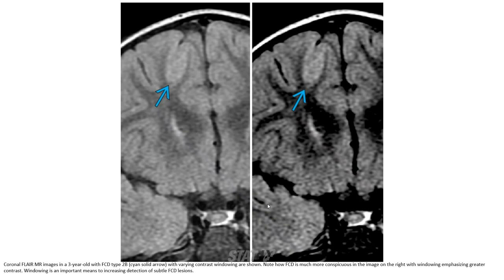This is a coronal FLAIR image in a 3-year-old with focal cortical dysplasia Type B, with varying contrast windowing shown. Note how focal cortical dysplasia is much more conspicuous in the image with windowing emphasizing greater contrast. Windowing is an important means to increase detection of subtle focal cortical dysplasia on MRI.